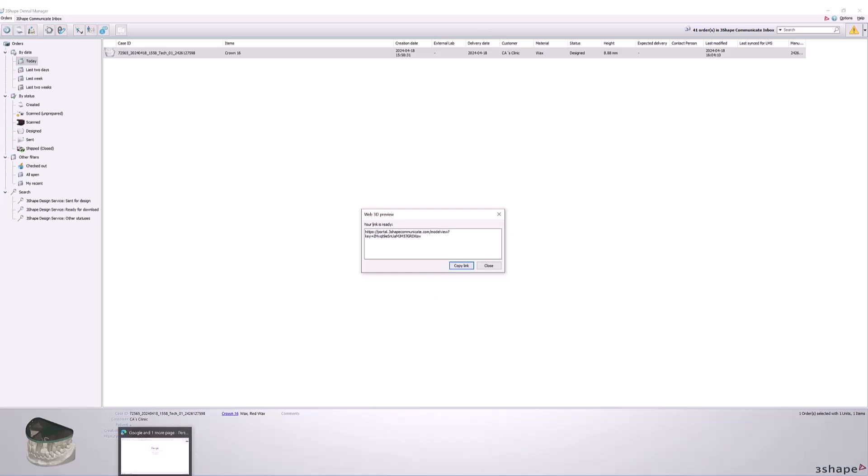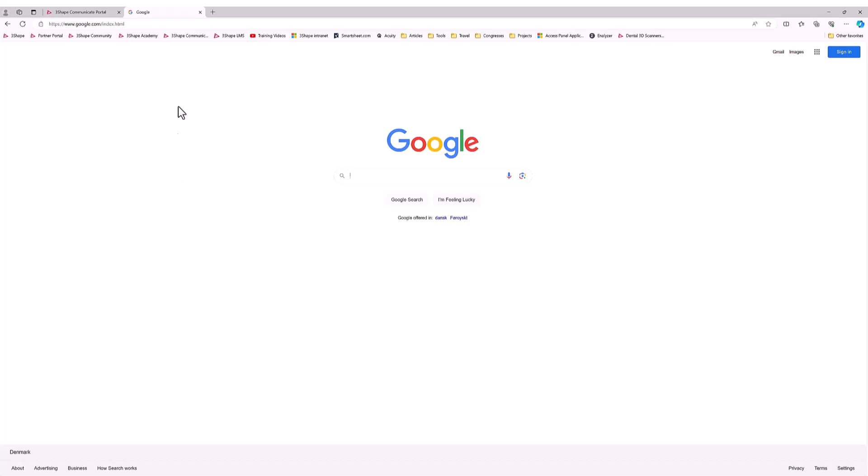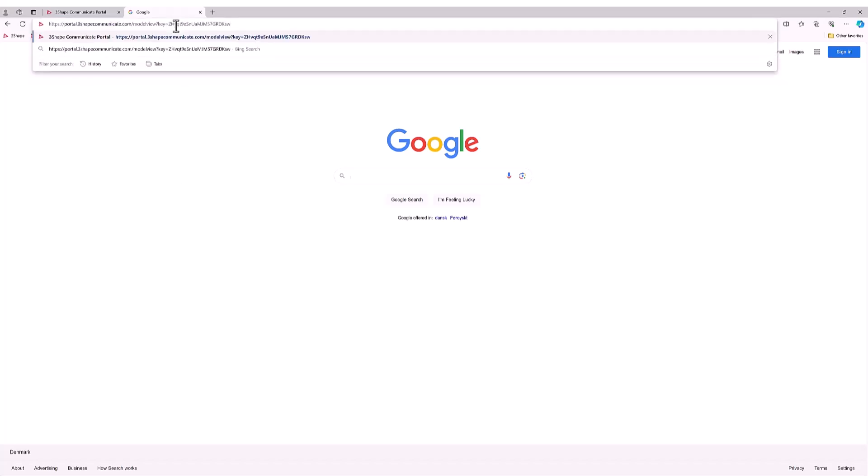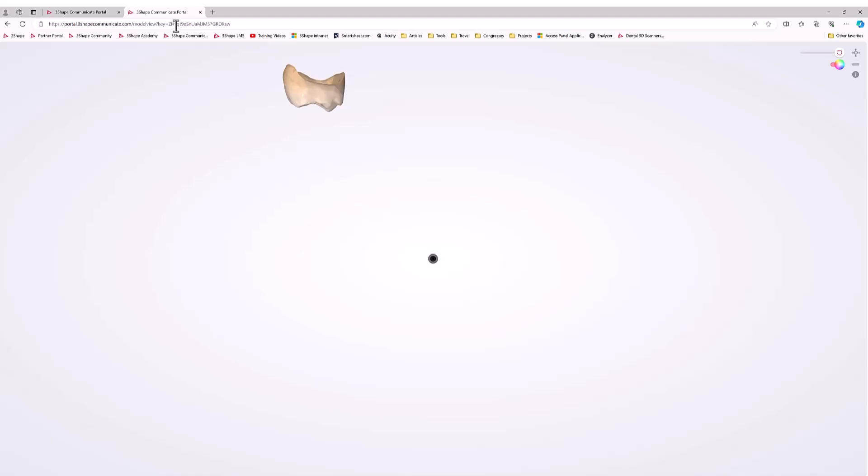Cases can be previewed in all major internet browsers, and links will be valid for one month with no size limitations.